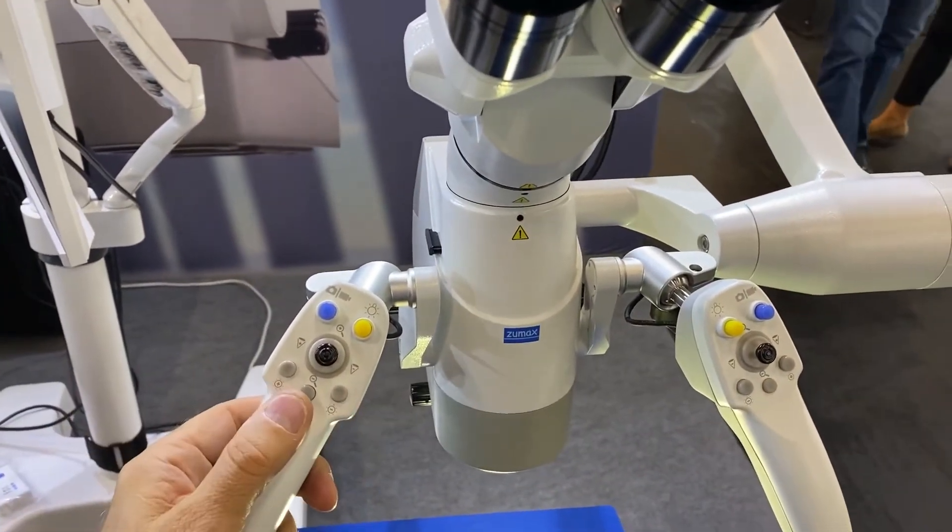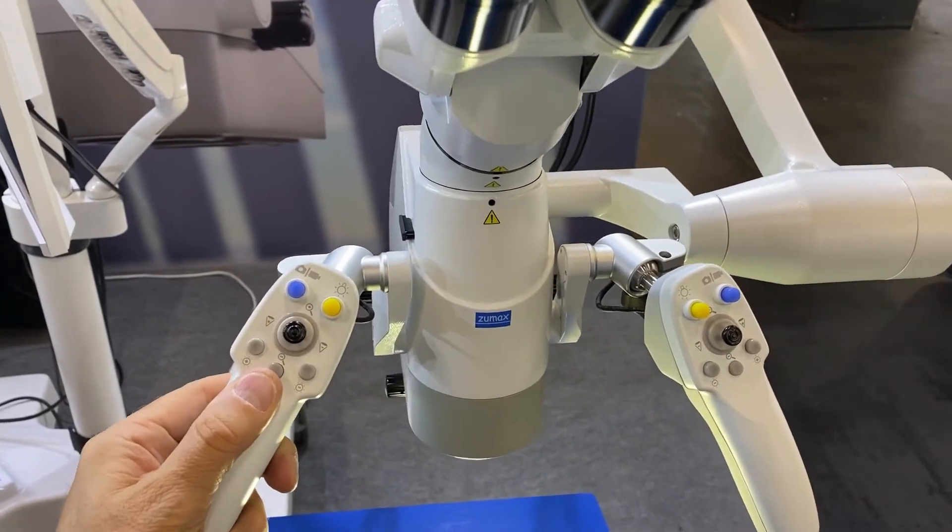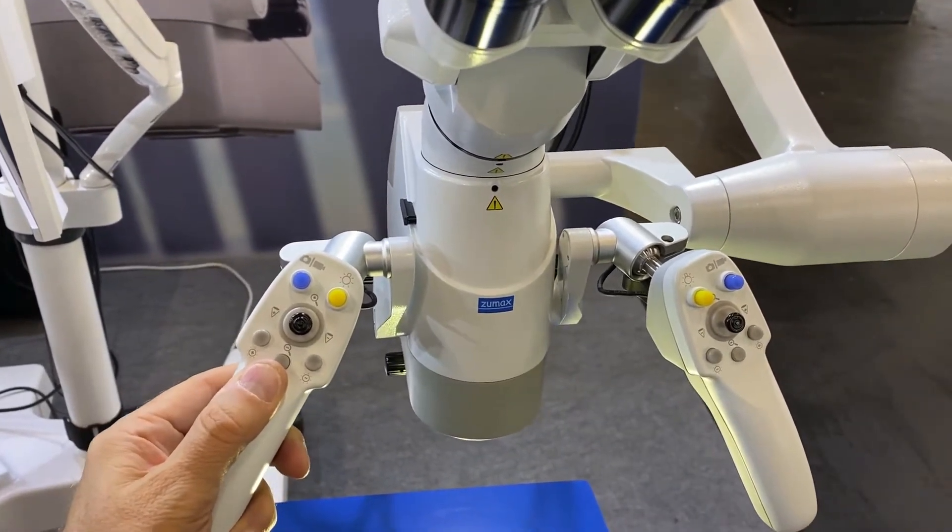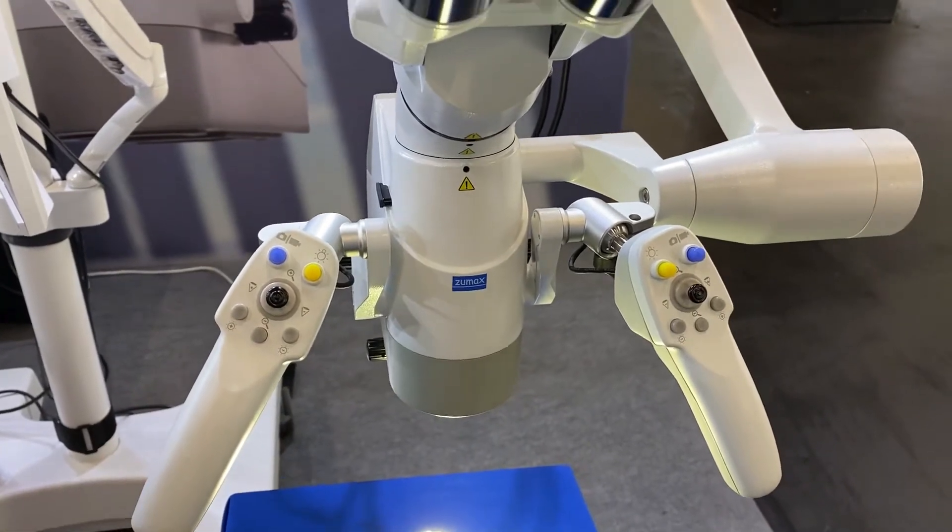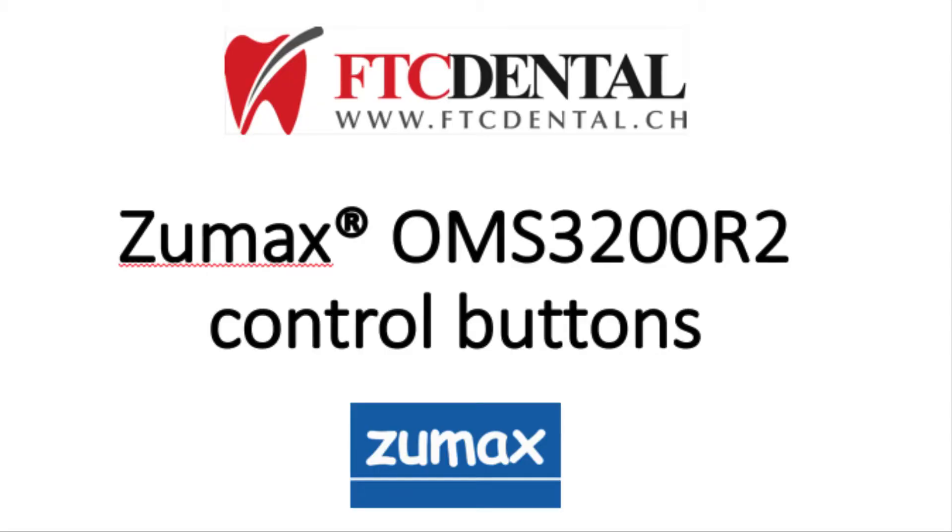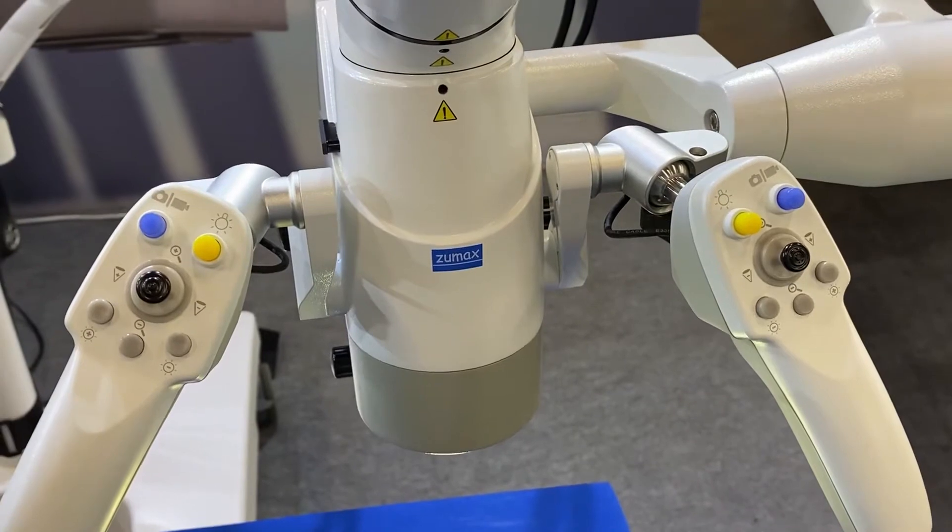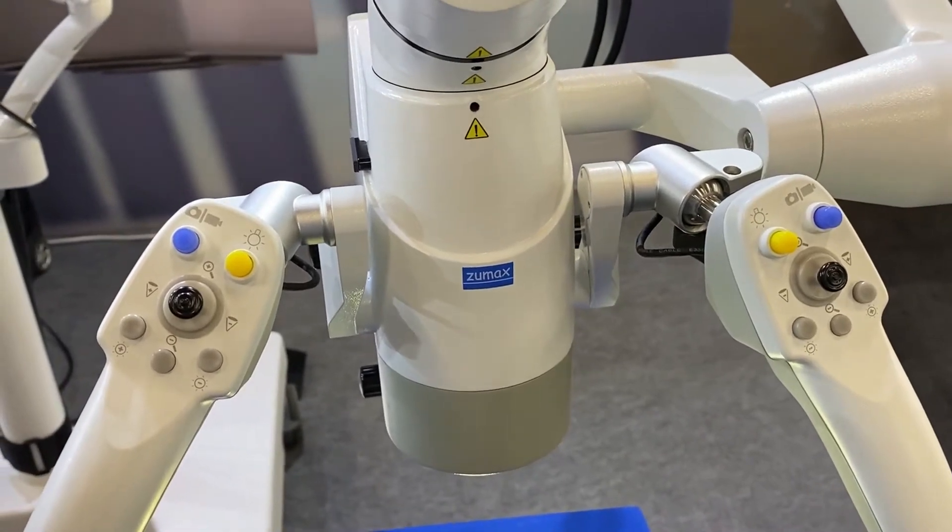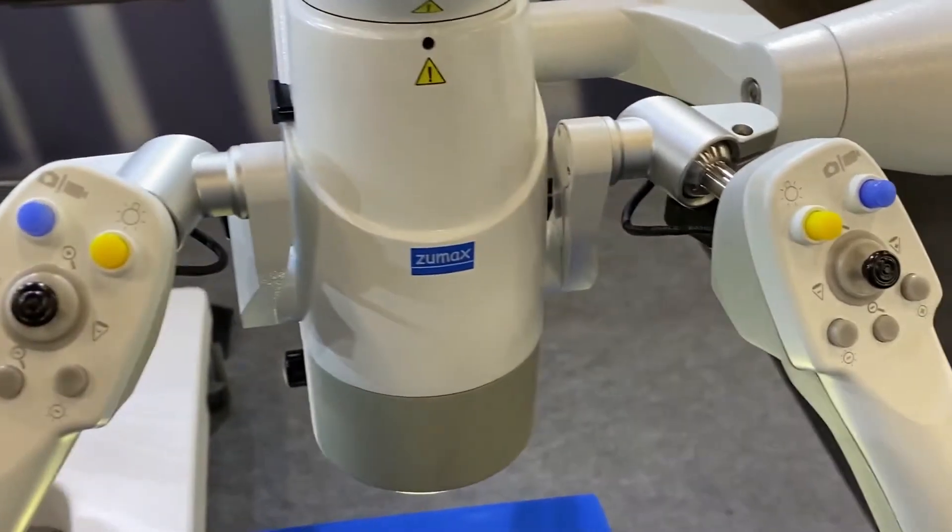You have the brake on the bottom here so you can move this microscope and when you let the button go it will stop and fix. Actually on this OMS3200R2 the buttons of both sides are the same.